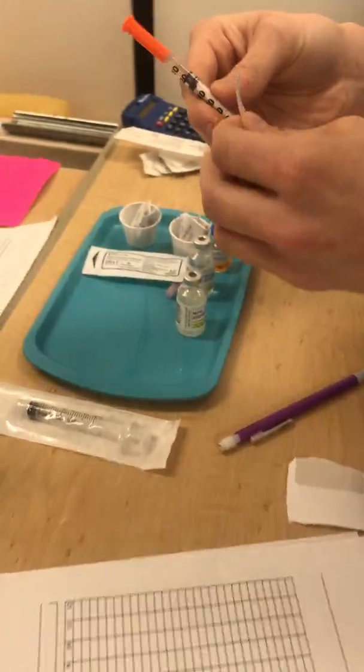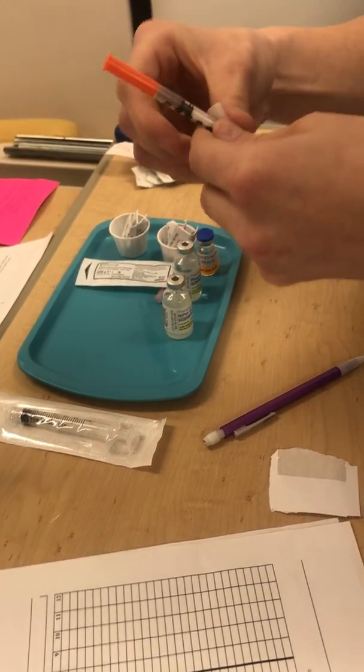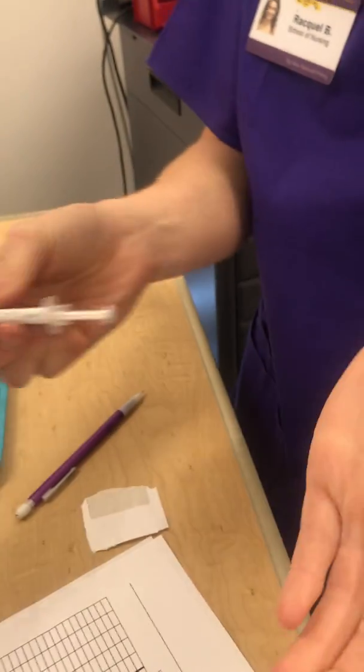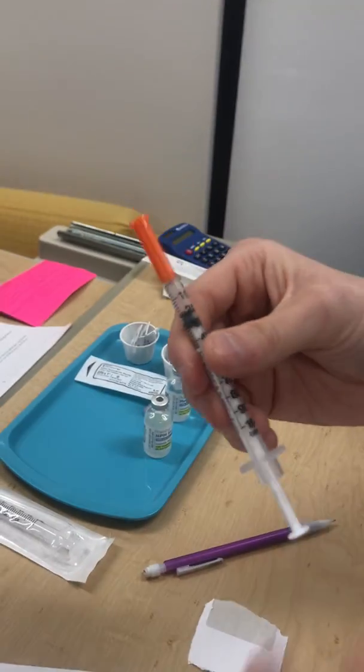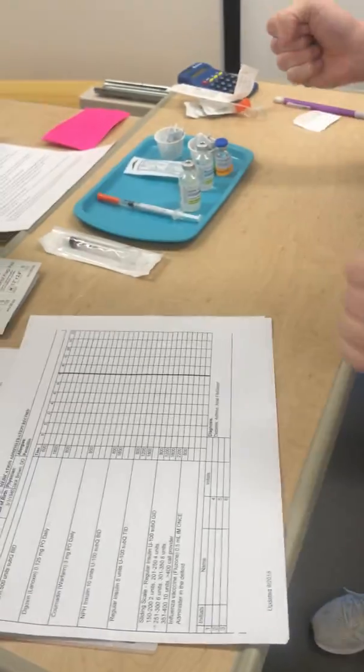I'm going to put it directly onto this because I just want to do that immediately, trying not to cover up the numbers. And then, so there's that one, and then my other nurse had watched me draw it up, checked with me that this is exactly 21 units is what I need. So there's that one.